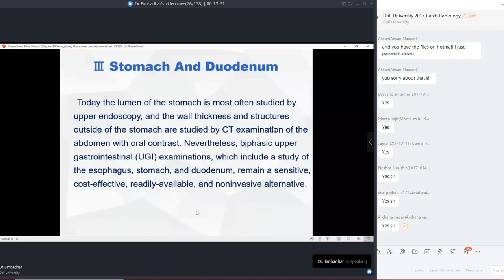You have to understand, in any kind of endoscopic study, the endoscope is a metallic camera tube which is inserted into the stomach from the oropharynx. Since it is a metallic flexible tube, it possesses a risk of perforation from the entry point till the exit point. Perforation can happen at any level. The most important complication related to endoscopy is that it is completely uncomfortable. It needs a lot of preparation beforehand. For example, you need to anesthetize the patient, prevent the gag reflex, and you need an experienced physician, a licensed endoscopic physician, a surgeon, or a technician to do this.